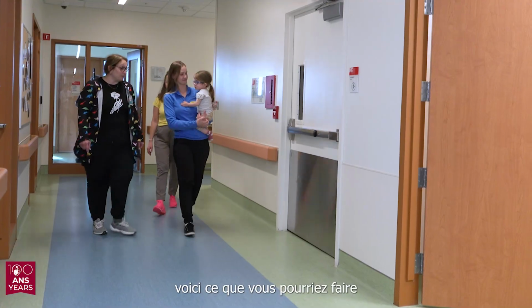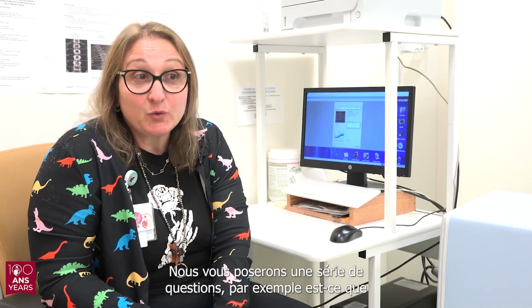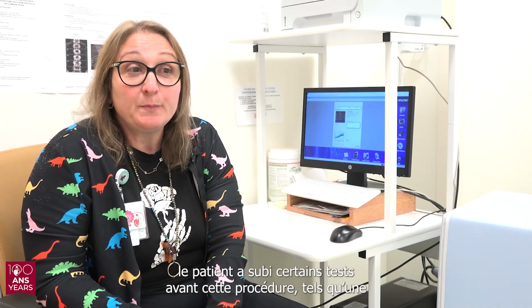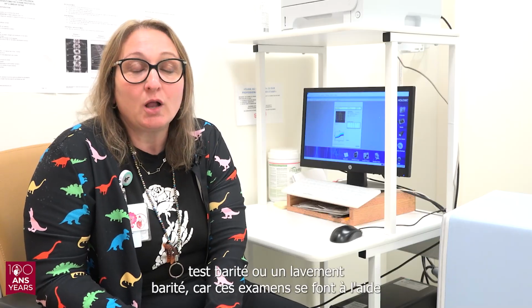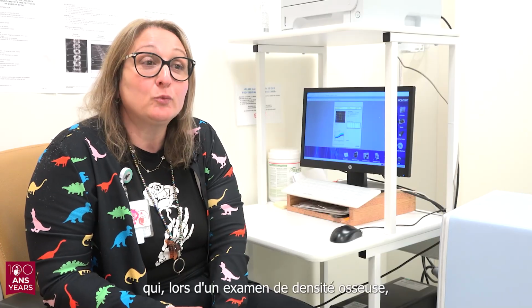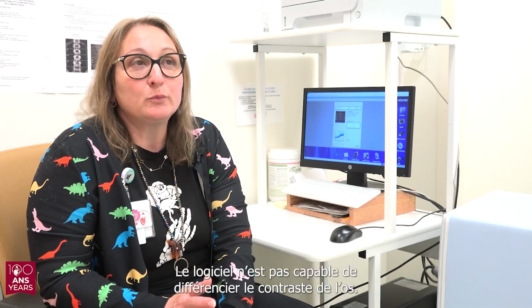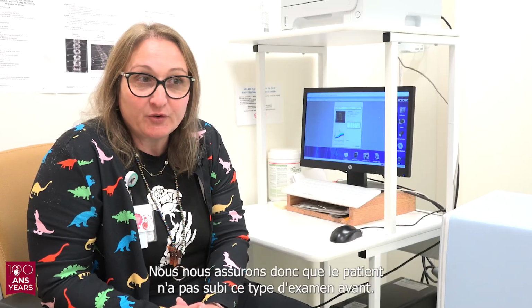For new patients and new families, here's what I would suggest that you prepare for so that you are aware before starting the exam. There's a series of questions that we ask, such as if the patient had certain tests before this procedure, such as a CT, an MRI, upper GI, barium swallow or barium enema, because those exams require contrast. And when we see contrast on a bone density exam, it could mimic bone. The software is not able to differentiate the contrast from bone, so we make sure that the patient is cleared from that.